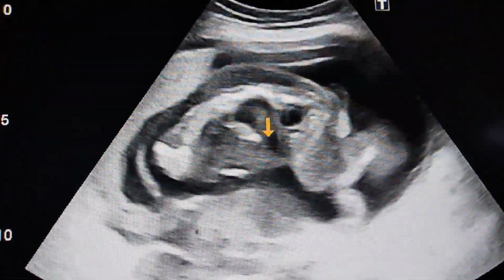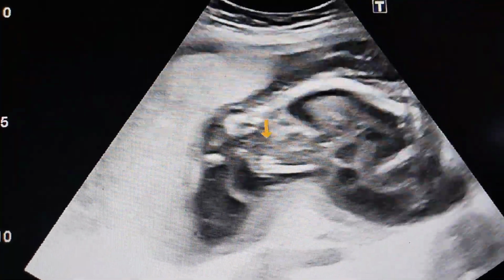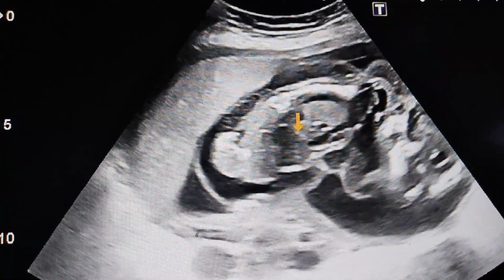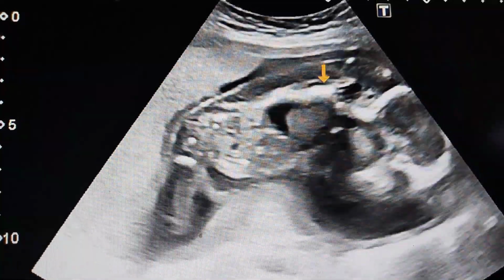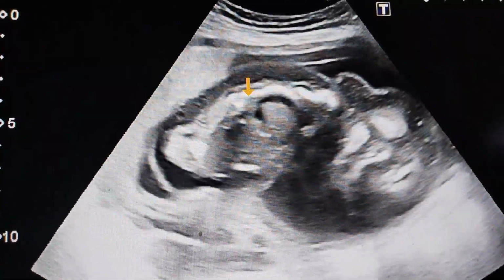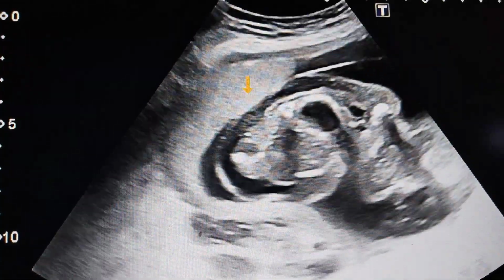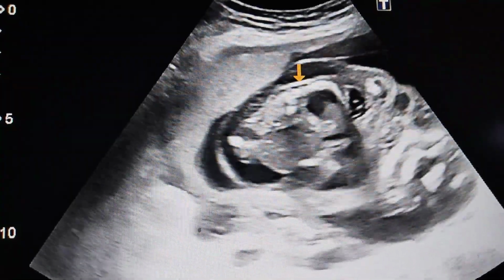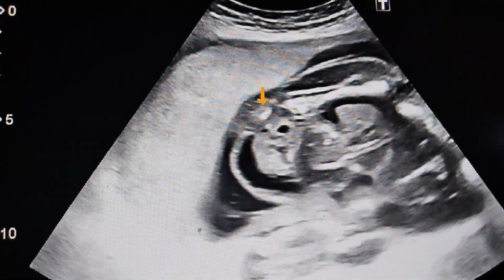So this is a case of Hydrops fetalis, as fluid is present in the pleural cavity, ascites is present, and generalized subcutaneous edema is present. So three findings are present. There should be at least two findings, fluid accumulation in two compartments. Then we can say that it is Hydrops fetalis.